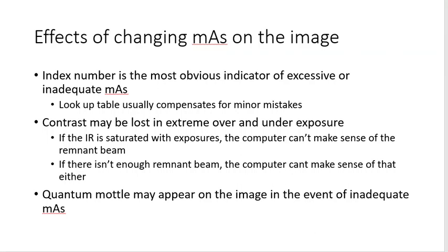So the doc looks at these images. He looks at image 1 and he says, okay, that's not good, the contrast is too low, so they'll show him another one, higher contrast, and maybe it's a hand. He says, okay, that one's perfect. So they save that one. That one becomes the histogram for which every single hand x-ray is compared against and adjusted to try to make it look just like that hand x-ray. That stored histogram is what we call a lookup table.